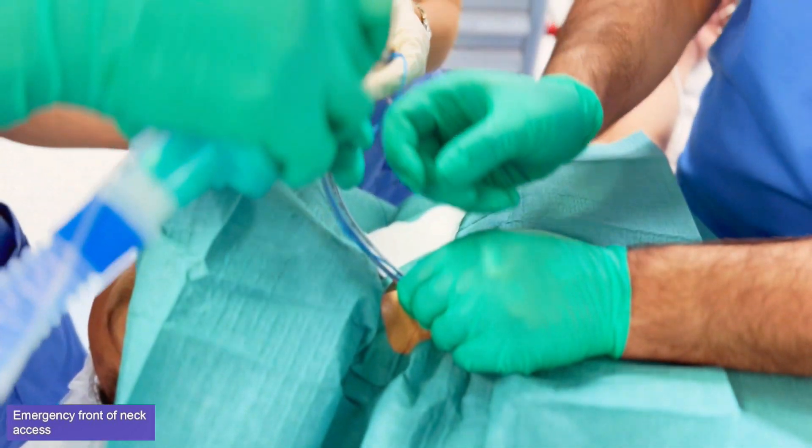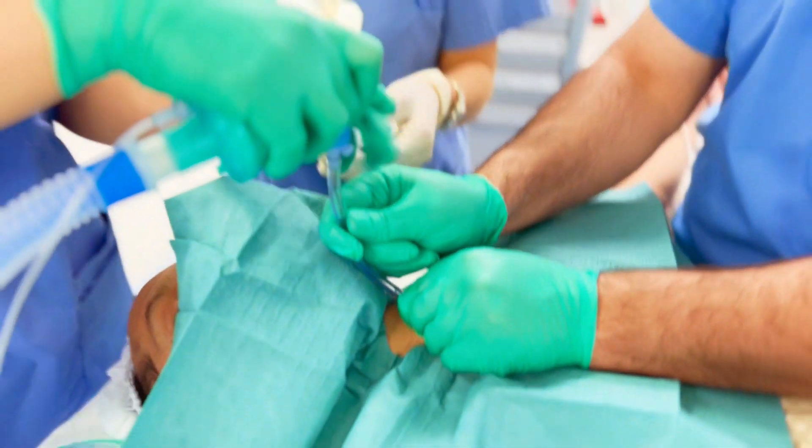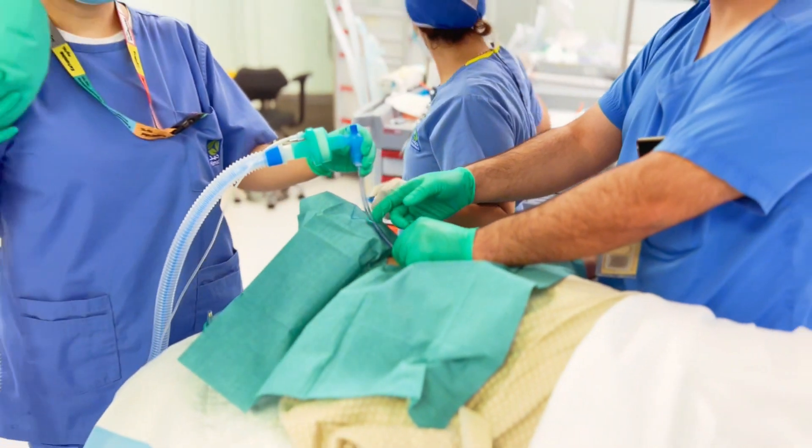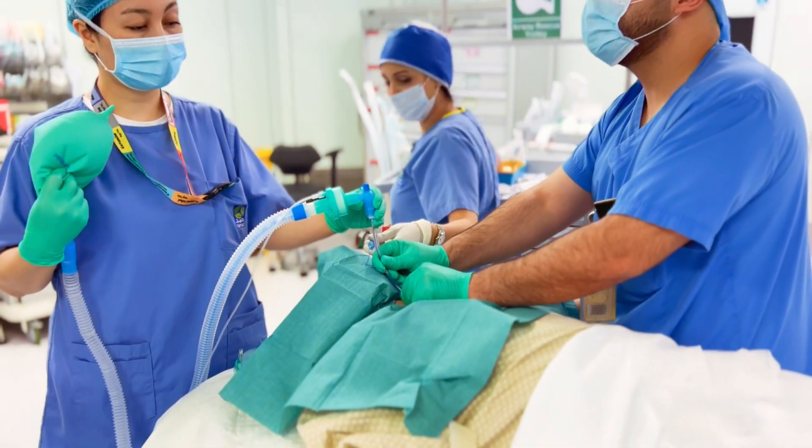Inflate the cuff. Attach the circuit and confirm ventilation with capnography.